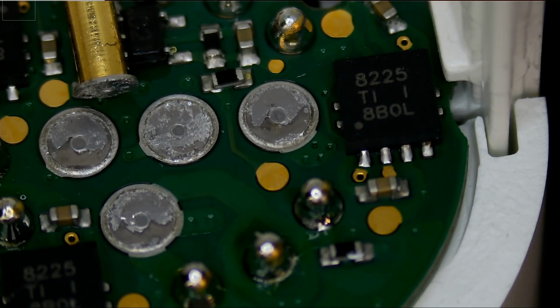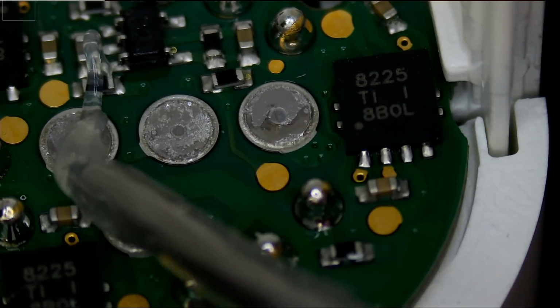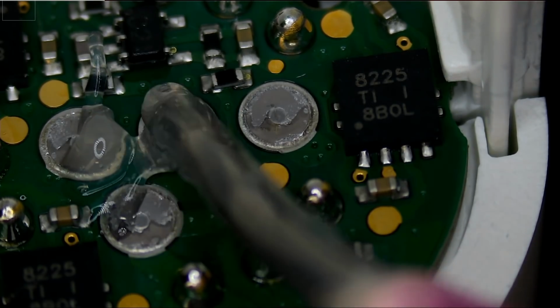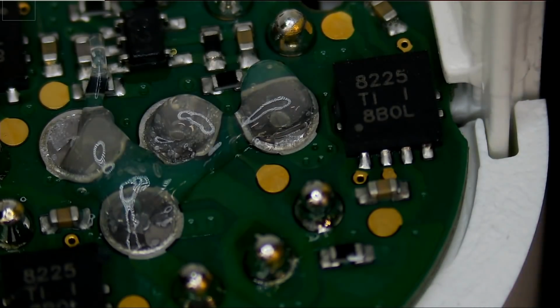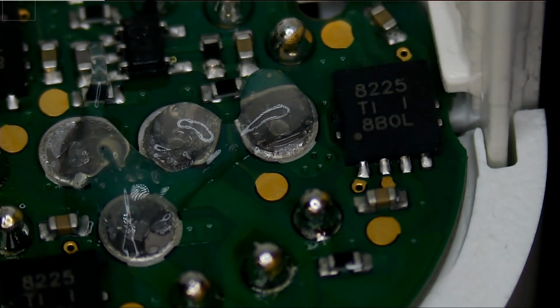Normally this job is not really difficult if we have the board laid down flat on the bench and we're looking at it under a microscope, but it's a little bit awkward dealing with this because the board is tilted at a 45-degree angle. I'm going to apply some flux. Fume extractor on. And we're going to apply a little bit of solder on each pad. Let's go ahead and do it.